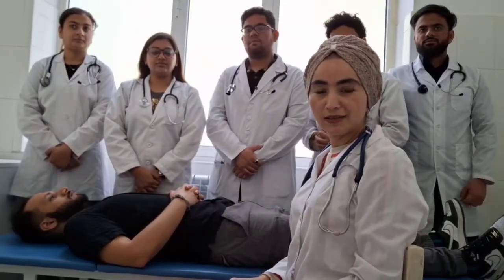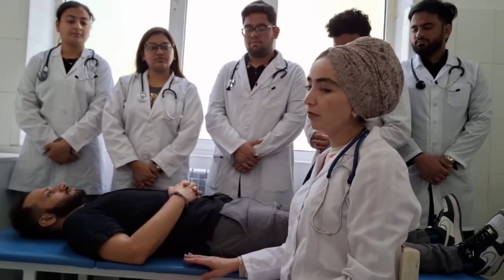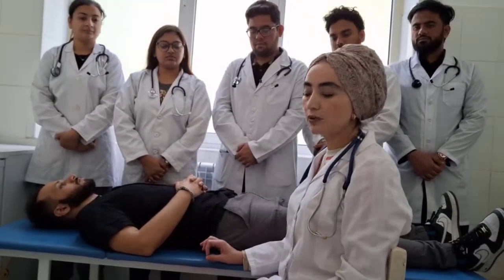Hi guys, today's topic is checking blood pressure. For best position of the patient, lying position is preferred, but we can also check in sitting position. Never standing, because on standing, muscles contract and increase blood pressure.